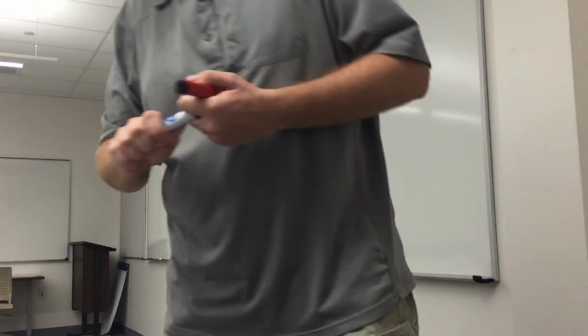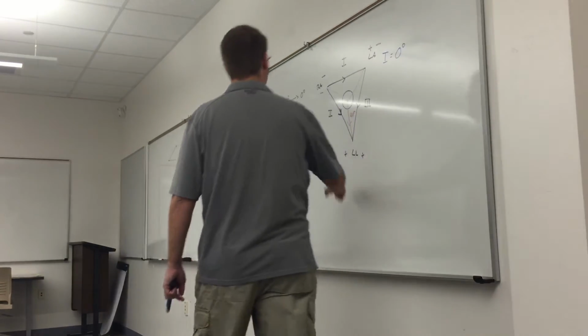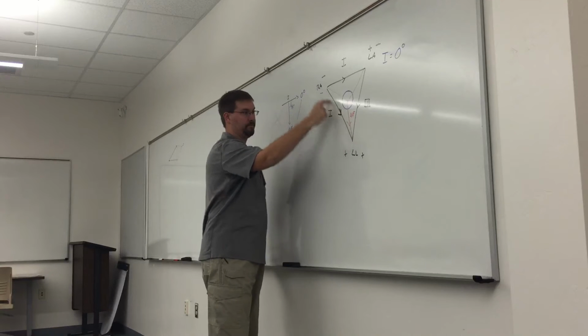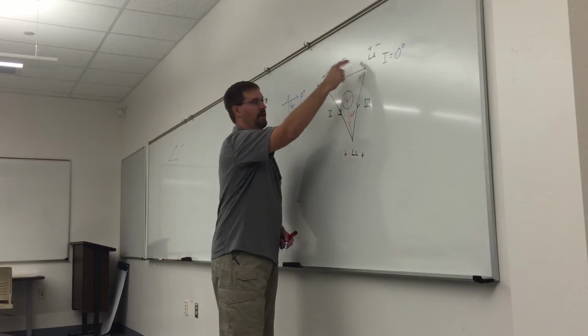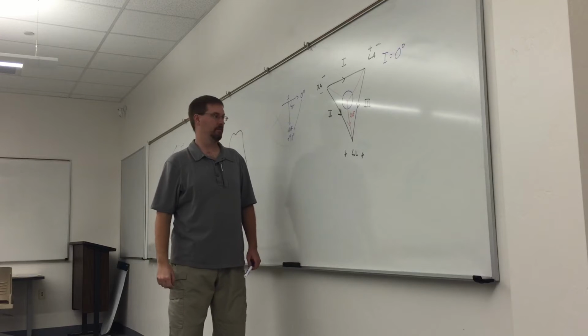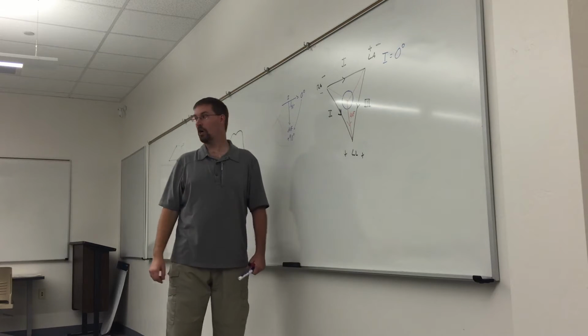All right, now let's look at lead 2. Where does lead 2 go here? In relation to 1 and AVF, where would you think lead 2 is going to be? 45. Close.